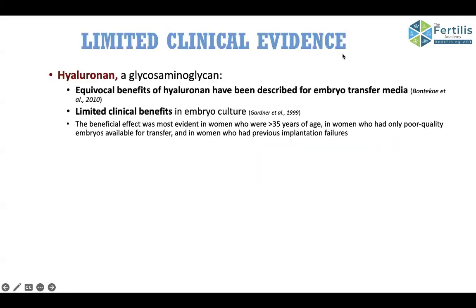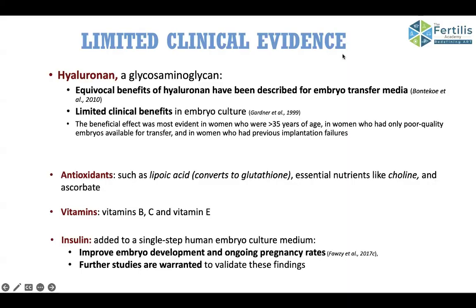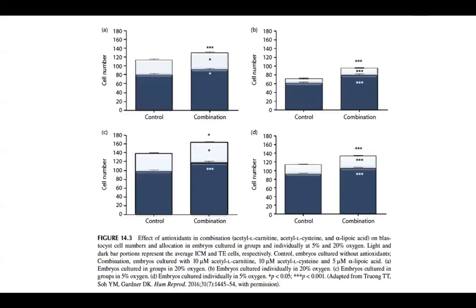So Dr. Lakshmi will be taking these micromolecules in the next session, so I'm not going to touch upon them. I'm just going to tell you that hyaluronate, antioxidants, vitamins, insulin, so many things are being added in the culture media nowadays, and they have shown limited evidence, but in some patients it has definitely contributed to pregnancies.